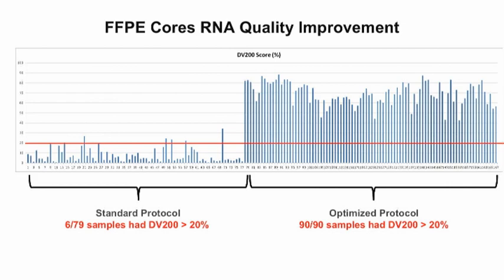Even more dramatic improvement in cores, which is why I mentioned that they're more preferred. If you actually look at the 40% line, there's really nothing even below 40%, with some of them even touching above 80%.